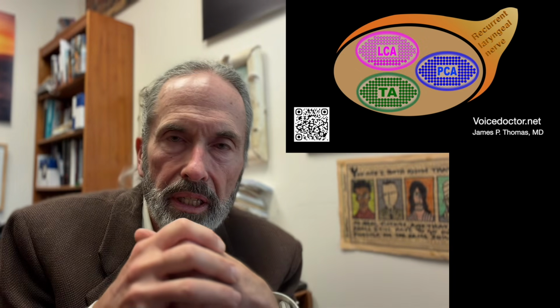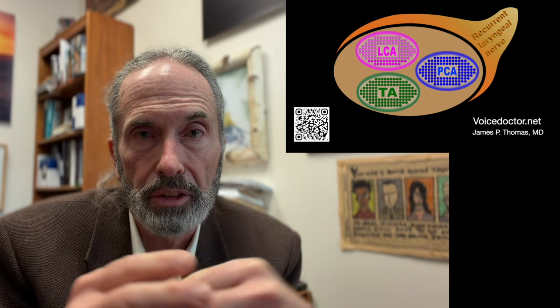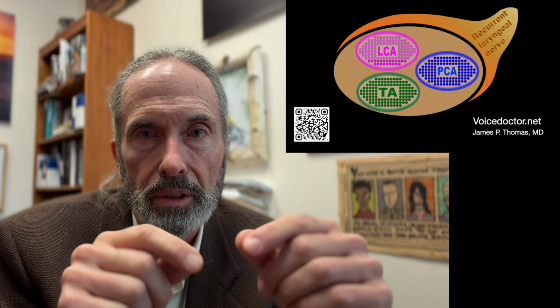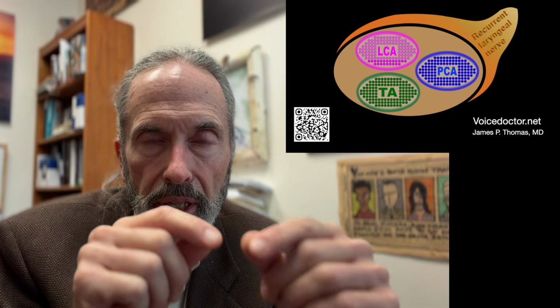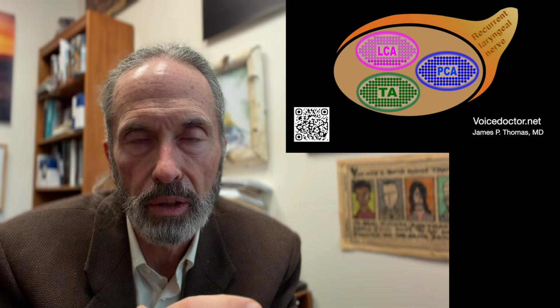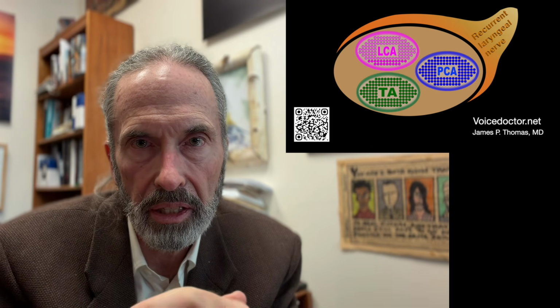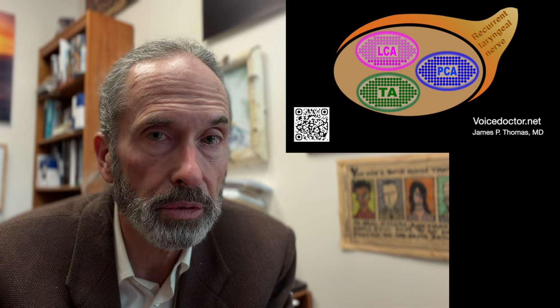That's my summary, or let's say, rather than a summary, that's my introduction, and you've learned that you can tell what's going on with LCA and PCA fibers going to the LCA muscle by watching the joint slowly, repetitively, in isolation, and that's an introduction to visual neurolaryngology.